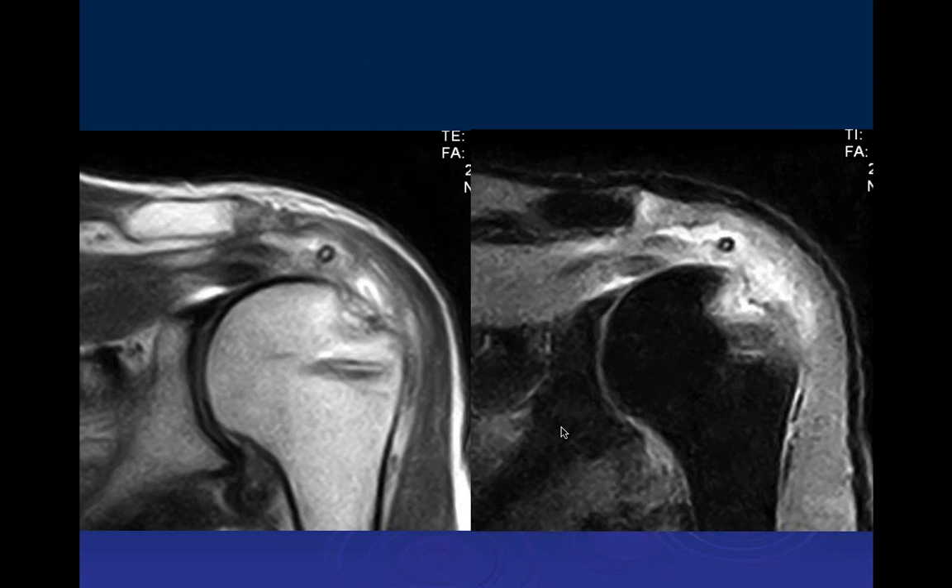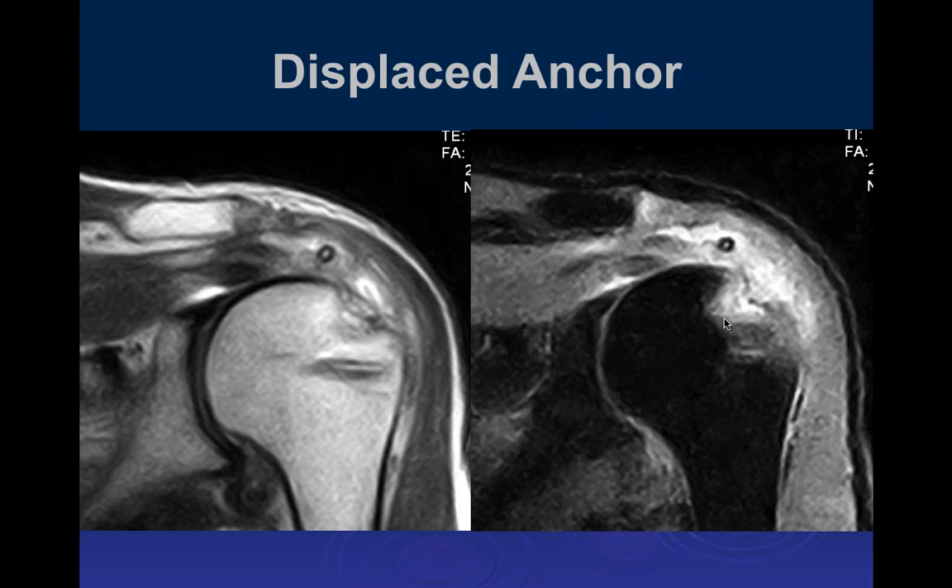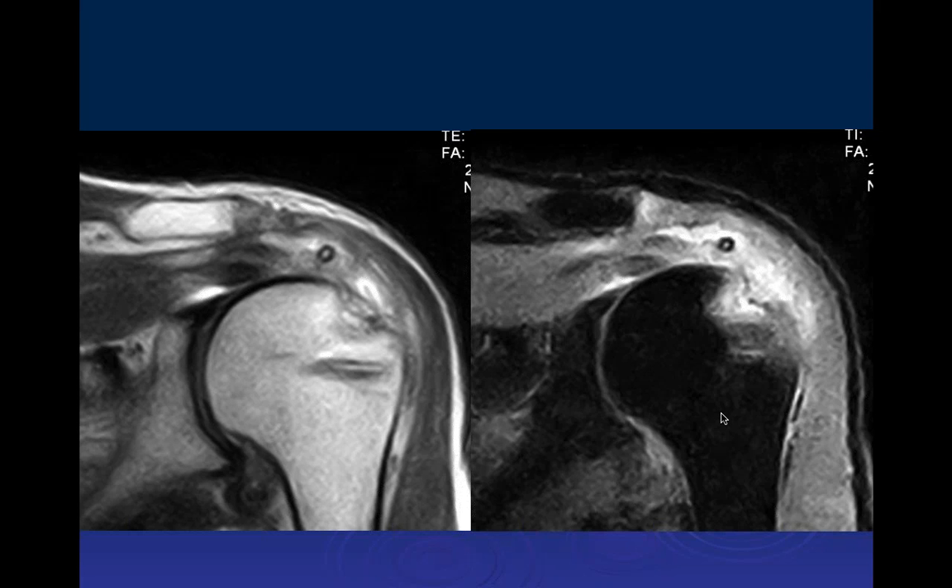Looking at this post-operative complication case, on sagittal T1 and PD fat-sat there is a round foreign body in the area of the supraspinatus. There is a defect with surrounding edema at the tunnel for the suture anchor in the humeral head. This appears to be a suture anchor that has been pulled away — the suture anchor has been pulled out, and we can see significant damage to the bone where it was.